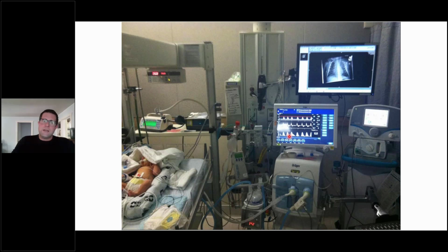Now, airway graphics, to a lot of people, may just be something that you look at outside the room to determine if the baby's connected to the ventilator and is breathing appropriately. And I often say the true artists are the physiologists in interpreting what's going on with your patient, because this patient's trying to tell you something. It could be something that could happen later or something that's existing in the current state. These airway graphics, especially in neonates, can be measured either back at the ventilator or at the patient.